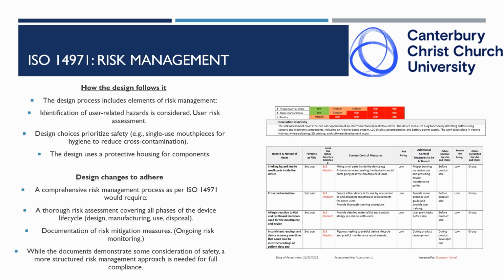Design changes to adhere to: what would we like to do better in our future work? As this project progresses, we would like a comprehensive risk management process, a thorough risk assessment covering all phases of the device lifecycle, including disposal, and documentation of risk mitigation measures as shown on the left here.